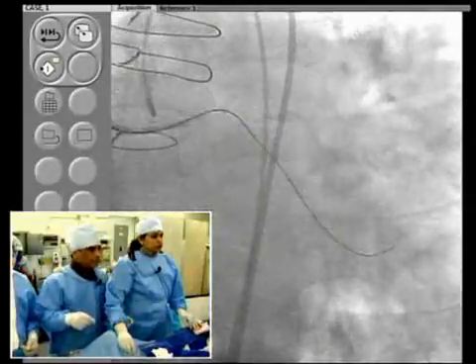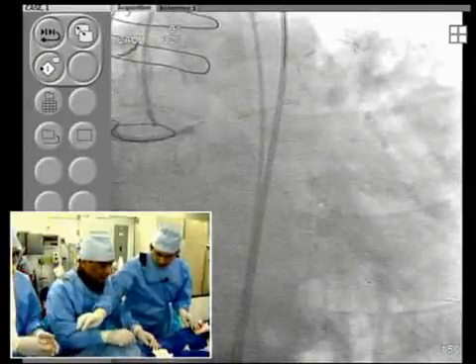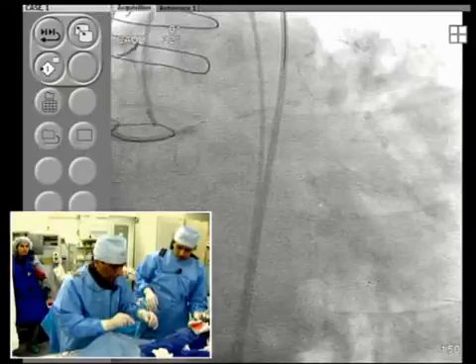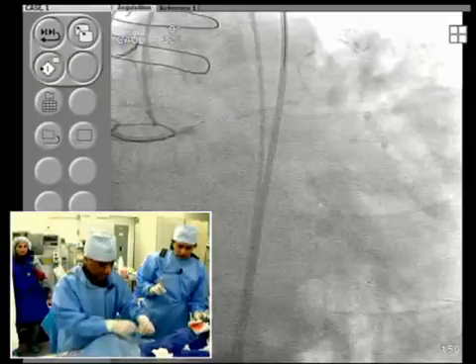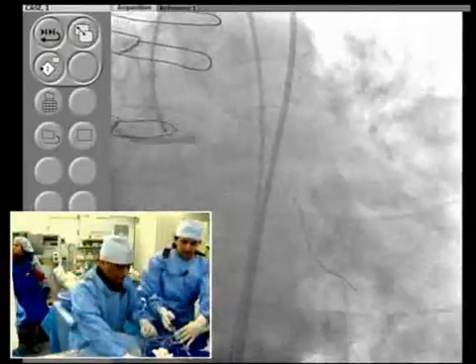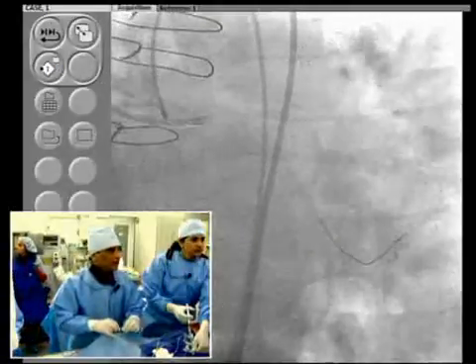Okay, good. Take it out. Good. Take the wire out then. Good, we'll see. Take the wire out. What wire do you have? A Grand Slam. Okay, now let's see if we can get into the main lumen. Which balloon do we have now? You've given up the habit of injecting through that to see where you are? Yeah, that's very rare. I'm not a big fan of it, because we have seen some cases of spiral dissection through it. Absolutely, because now if it goes, you are going to see it very clearly. Absolutely. Well, also with the contralateral injection, I think.